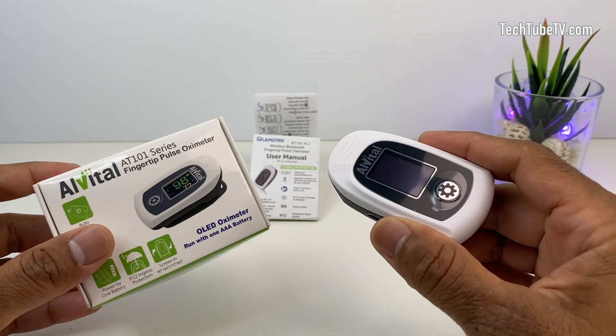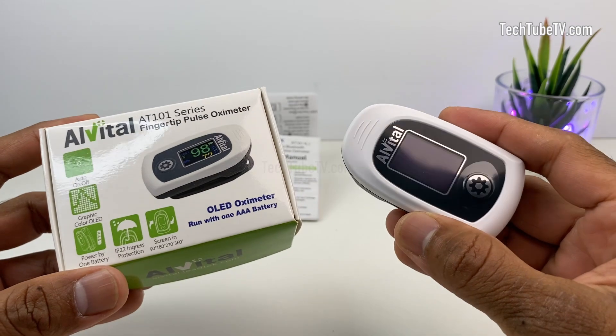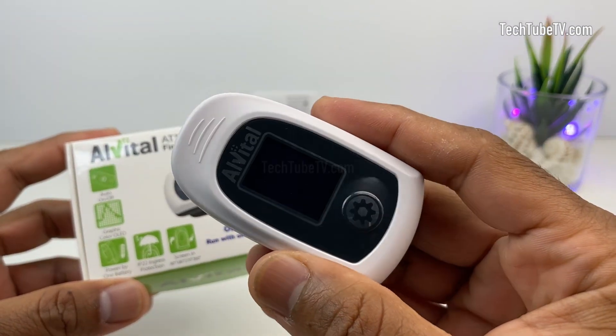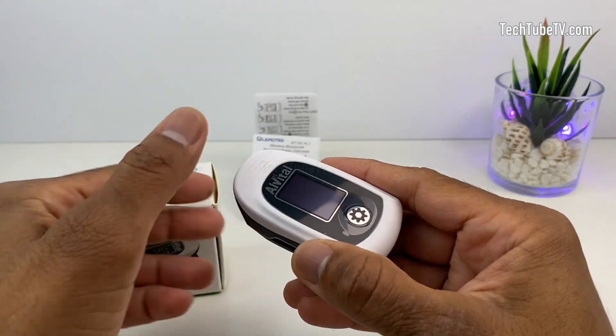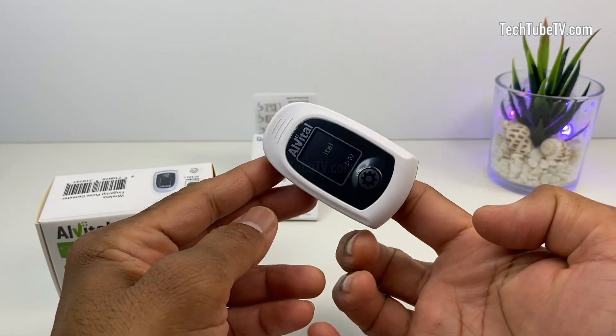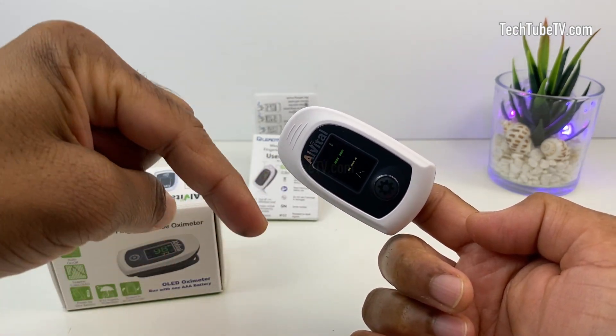If you need to monitor your blood oxygen level or heart rate with an easy to use, convenient and portable device, this Alvital fingertip pulse oximeter does a great job. You can use it to monitor for health purposes or during fitness exercises. I have included links below if you need to find out more about this device.